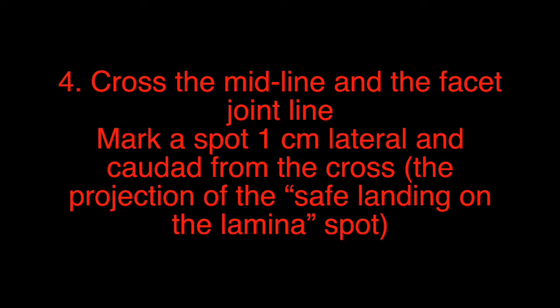Step 4: Cross the midline and the facet joint line. Mark a spot 1 cm lateral and caudad from the cross. This is the projection of the safe landing spot on the lamina.